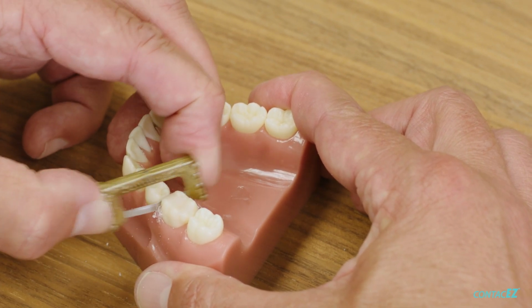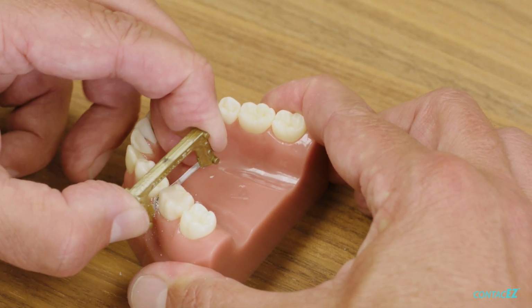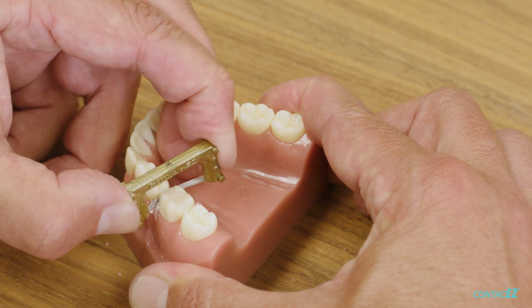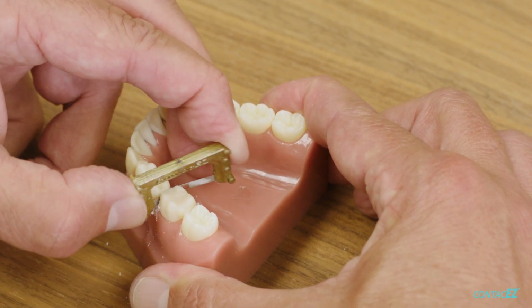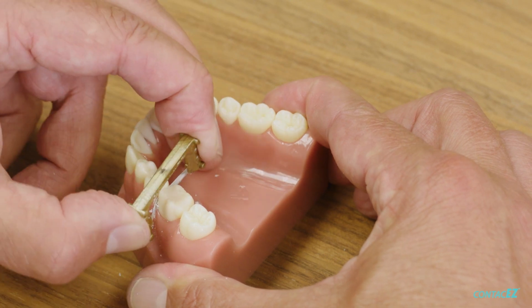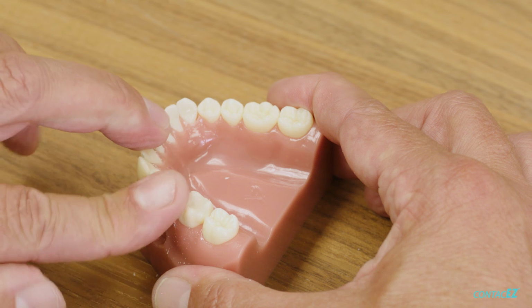We're definitely getting the handles a lot closer to the tooth themselves as we go in there. And you can feel it as it smooths off. You'll be able to feel that in a tactile sense, you'll be able to feel that, okay, I've got my shape now, and as I come around here, it doesn't feel as lumpy as it did before.